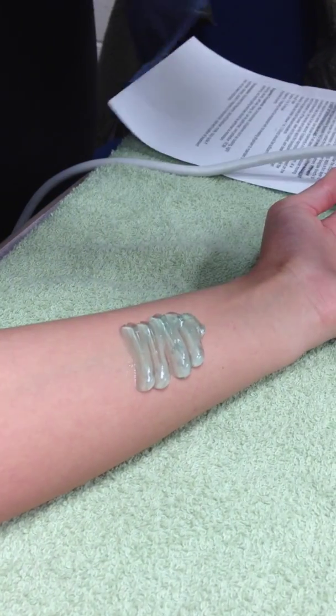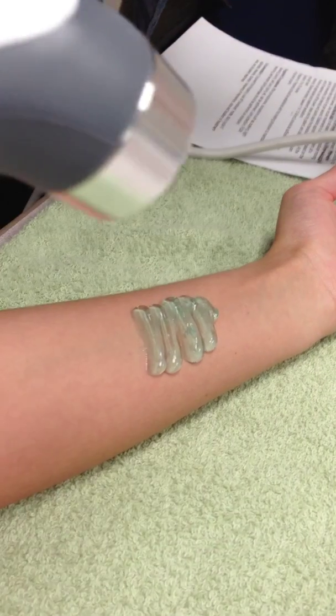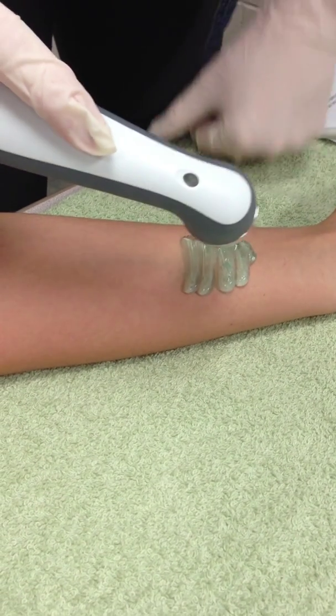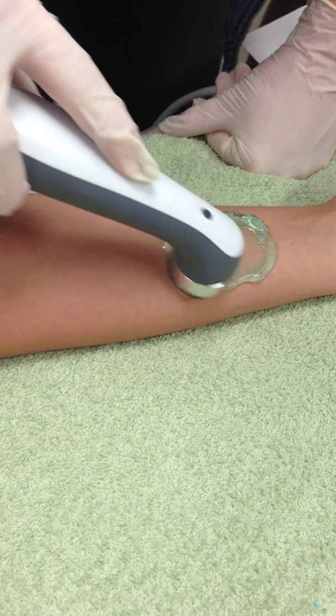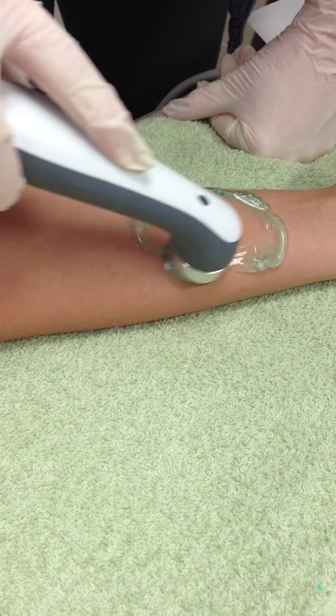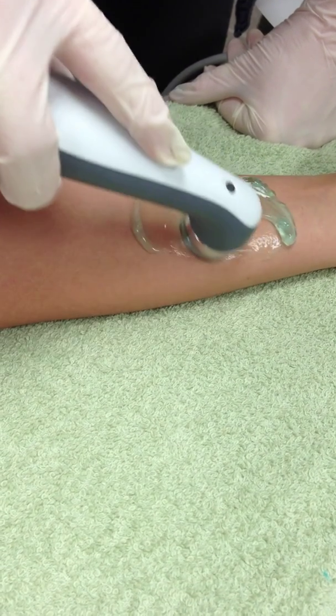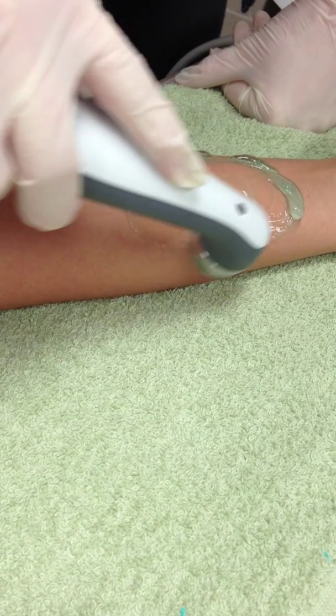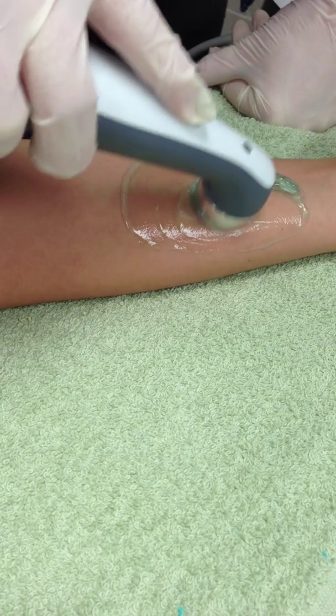We're going to start and then immediately apply the transducer to the skin. And just stay in the area that you want to work on, moving at a good rate.